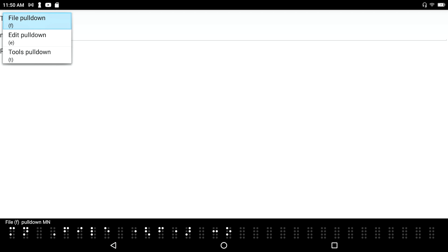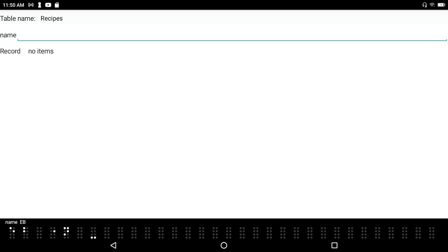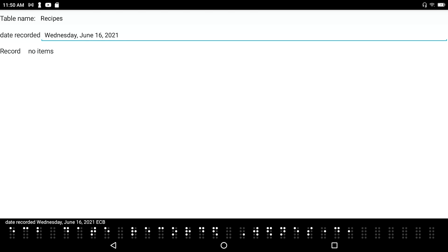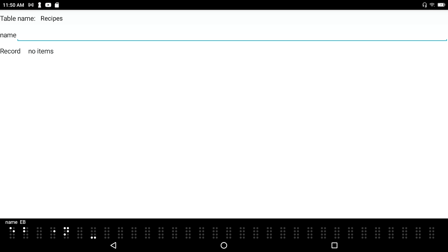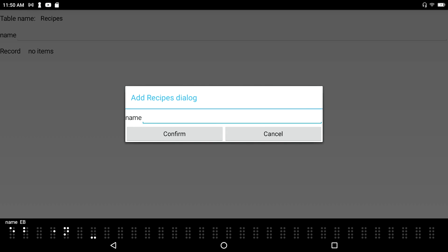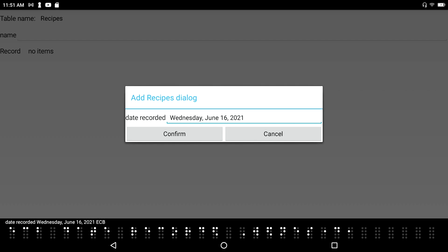I press Enter-I to create a new record within my database. The Add Recipes dialog opens. In the name field, I'm going to call this jambalaya. The date recorded shows Wednesday, June 16th, 2021 as an edit combo box, so I can change it if I'd like — I'll just leave it the same.